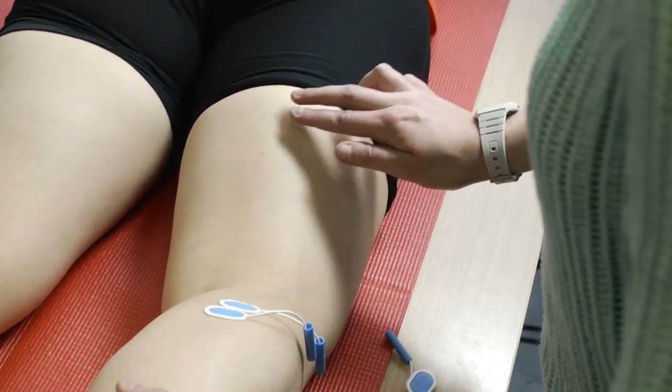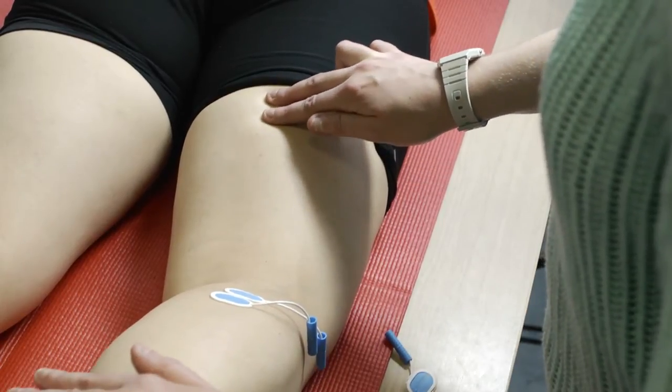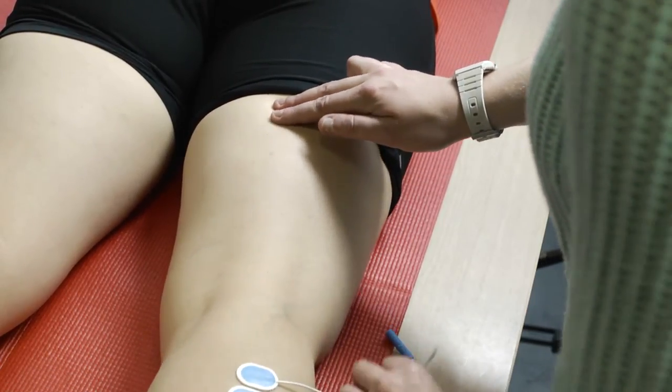And now we can see that muscle clearly appearing in the thigh. So I'm just going to find the centre of that muscle — and you can relax now — and I'm going to attach electrodes.